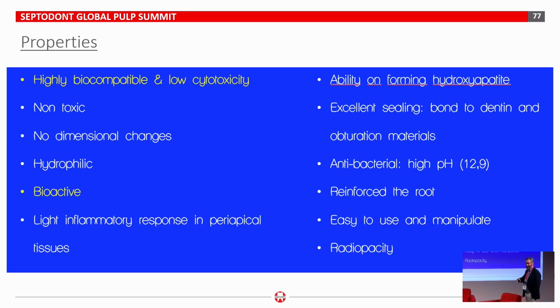It depends if in vitro or in vivo. It produces a light inflammatory response in periapical tissues. It has excellent sealing. It bonds to the dentin and to guttapercha. It's antibacterial because of the production of calcium hydroxide. It's easy to use and manipulate, and the radiopacity is adequate.